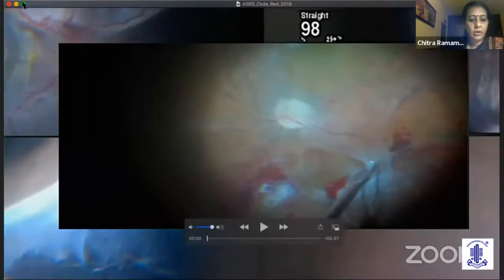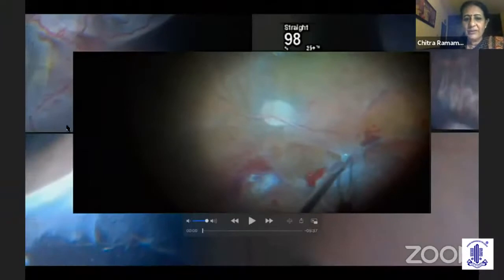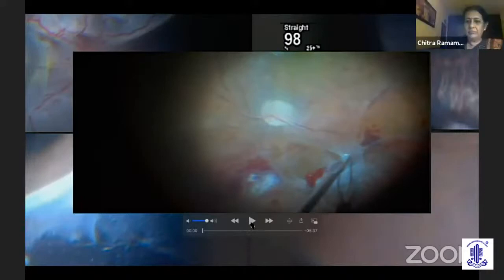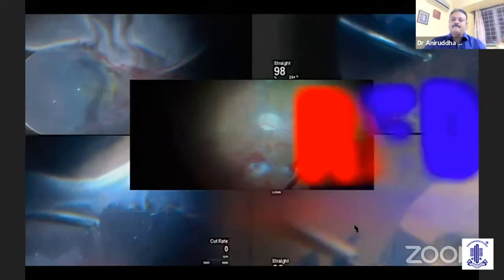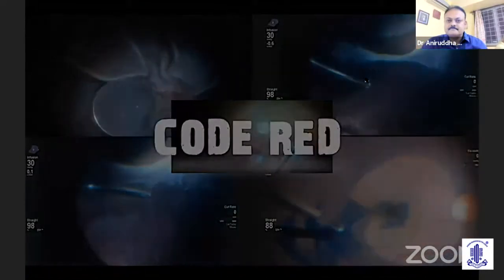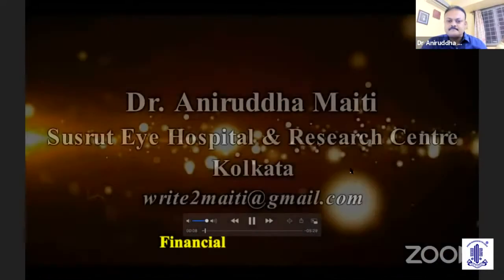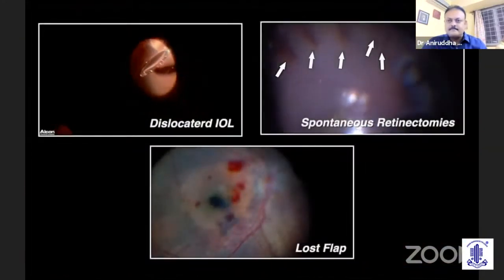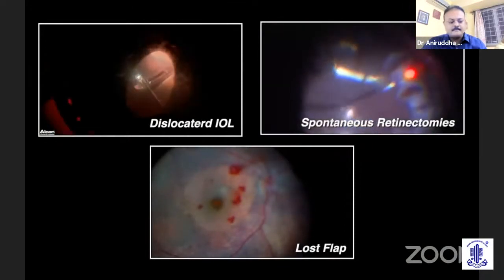He is going to be talking to us on intraoperative surgeries: bleeding, spontaneous retinotomies, and lost ILM flaps. Look forward to hearing about it. I will be showing a few of my intraoperative surgeries. Each one of us might have faced a difficult situation while operating. The cases may not be complex, but a complication might lead to a challenging situation. In this video, I will show complications occurring in three simple routine cases.